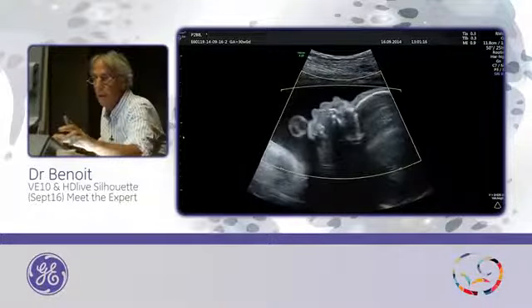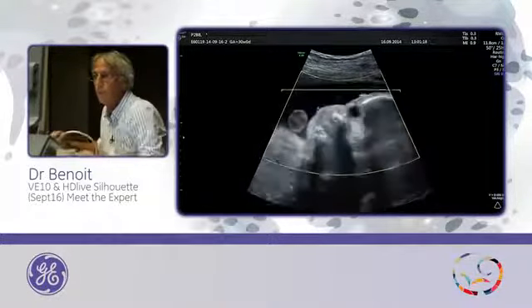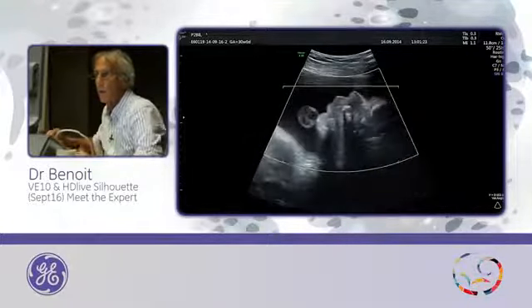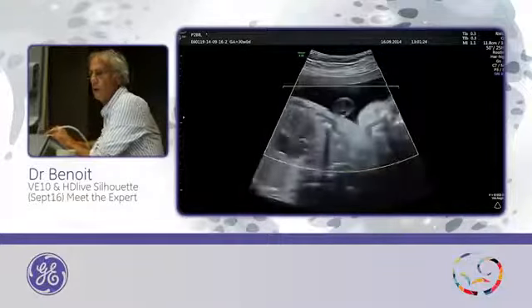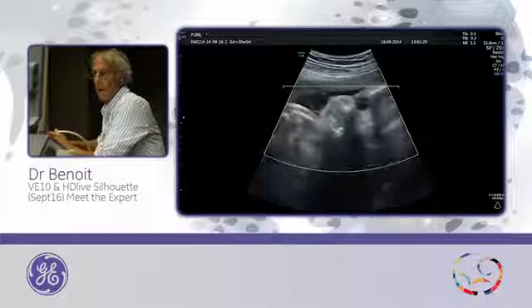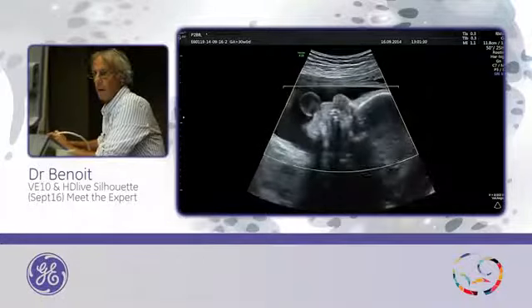The baby is really in a nice position for the face, so I will do it again. Maybe I have to push it. Okay. Start.